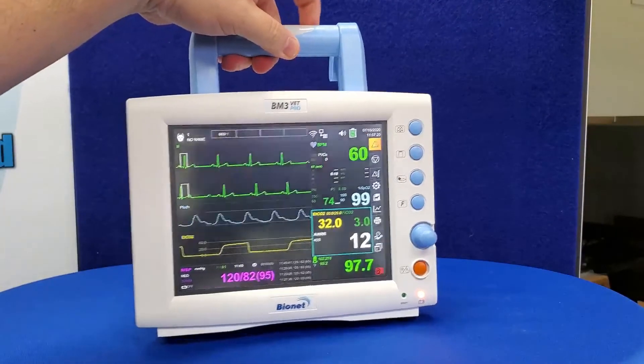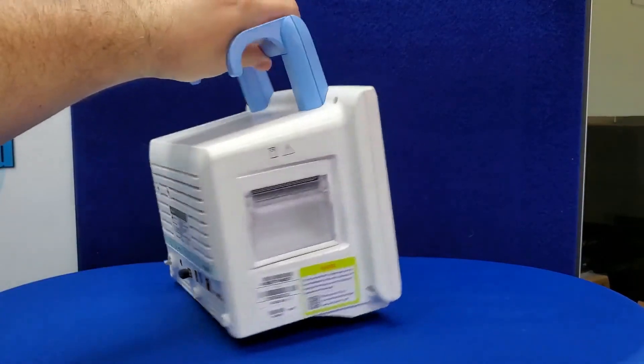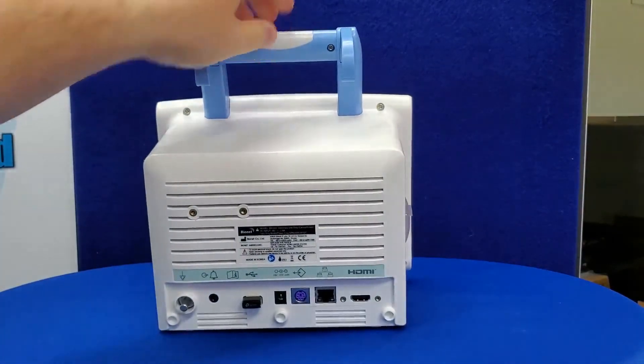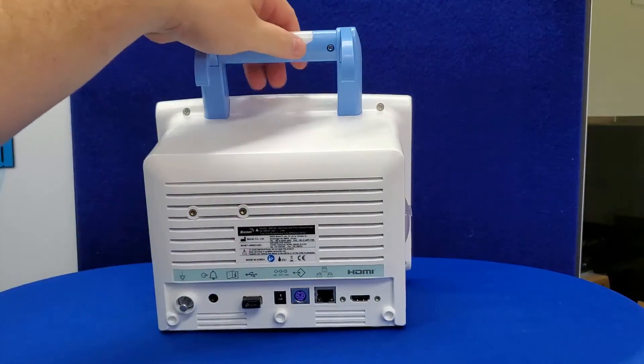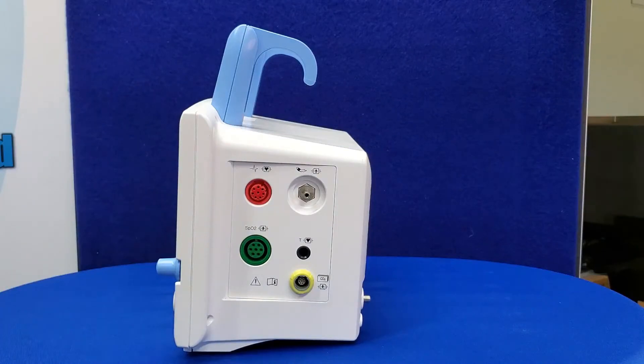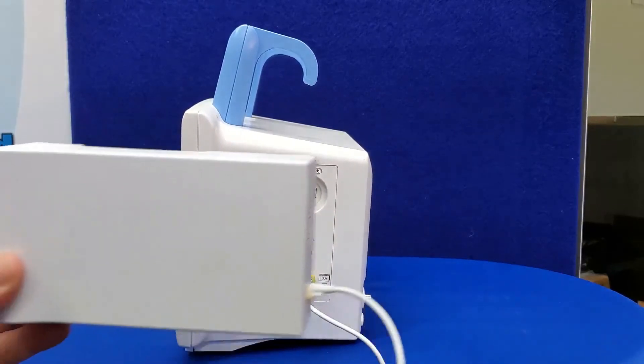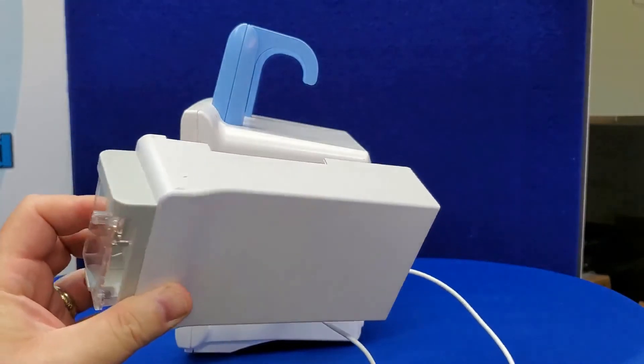All monitors now feature an LCD touchscreen, HDMI output for external screens, built-in printers, and USB ports for external data transfer. You can also expand the features of the Pro series by adding an ETCO2 sensor — both mainstream or sidestream — or Bionet's dual gas sensor for both ETCO2 and anesthetic gas monitoring.